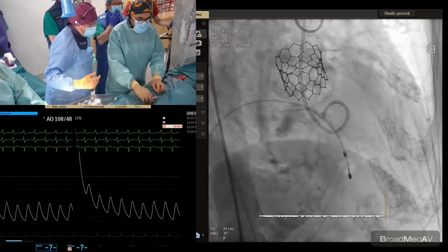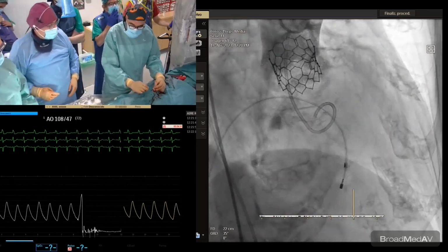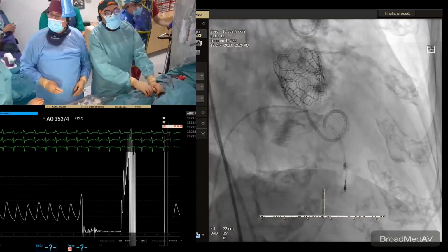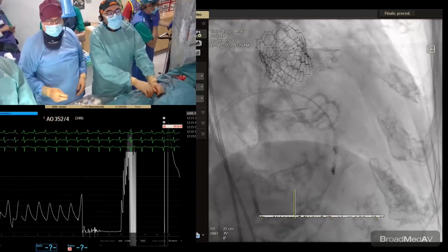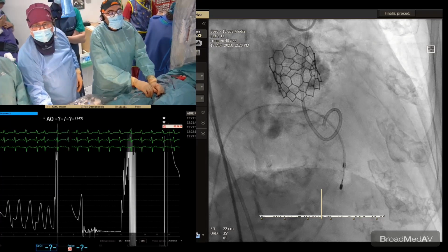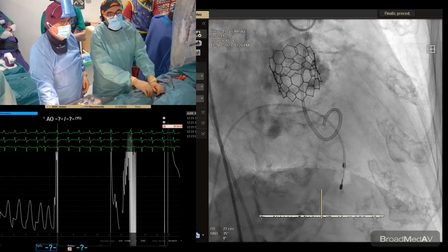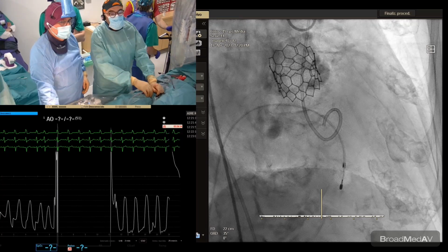Pues hacer una retirada buena. Sí, vamos a hacer. Yeah, we are going to see the ventricle while we are retrieving the pigtail from the left ventricle to the aorta. So we are using the MANTA device as the default closure device for TAVI. We have good results, but as everyone, we have some complications as always occur.